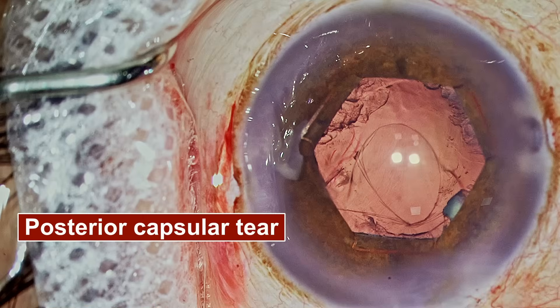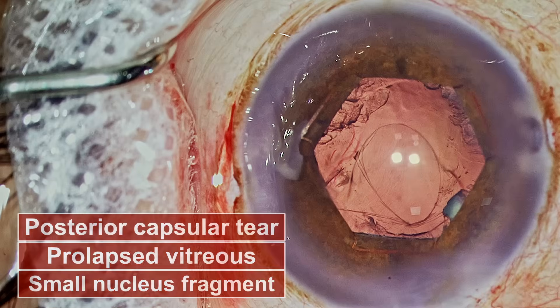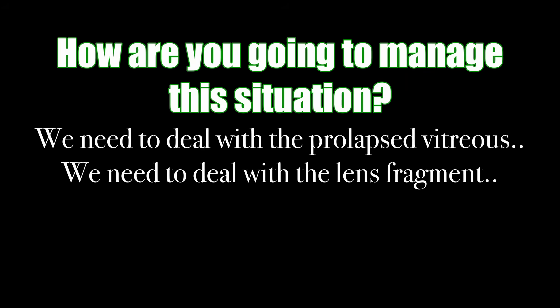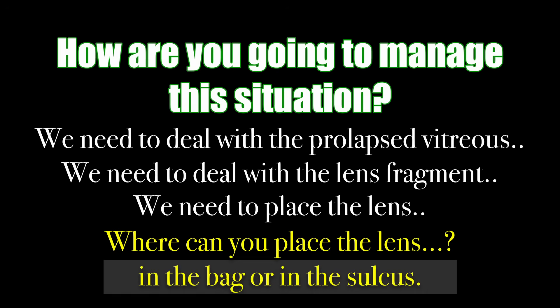So we have a PC tear with vitreous prolapse and a small fragment. Let me pause the video here — write down how you are going to manage the situation. We need to deal with the vitreous prolapse, deal with the lens fragment, and also put the lens. Where can you put the lens? Either in the bag or in the sulcus. Plan a strategy for how we are going to manage this case.